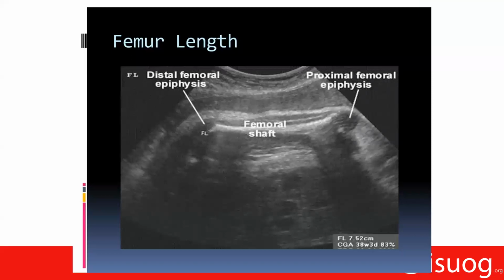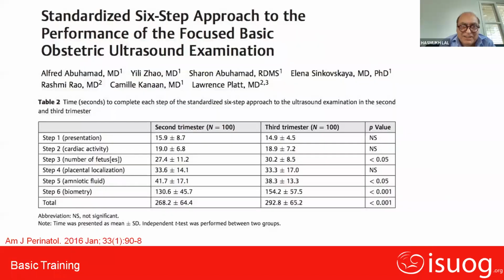The standardization slide. Yeah, you keep it there. Basically, what Ajit sir has been insisting all the time is to keep the transducer 90 degrees to the floor, perpendicular to the floor. We learned in physics that if we send sound waves at 90 degrees, perpendicular, every returning signal will be maximum.